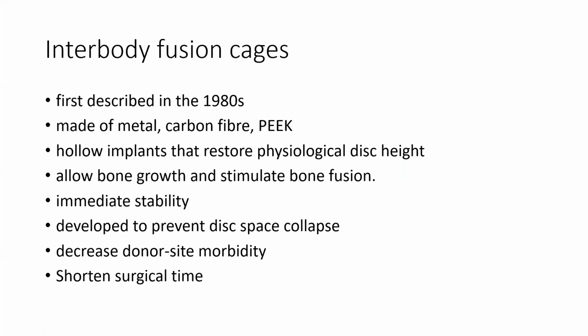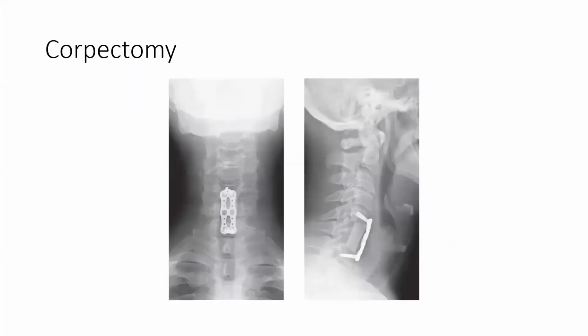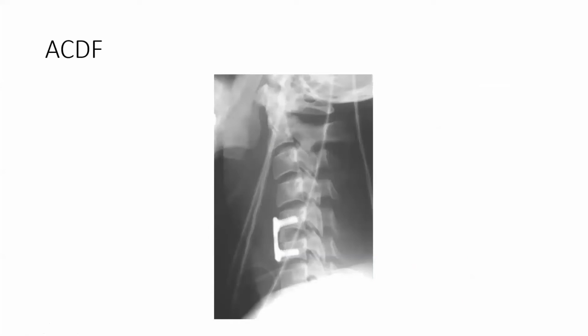So one of the concerns, if I go back here, you can see this one. He's had some bone graft put here. So this is trauma. In trauma, you want a plate to hold, remember you've torn through these facet joints, and in a trauma situation, you always want to put a plate.